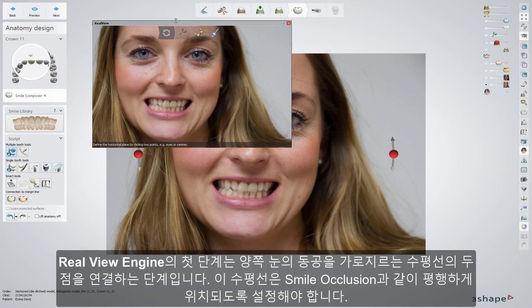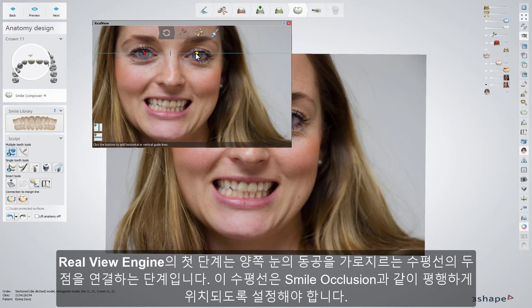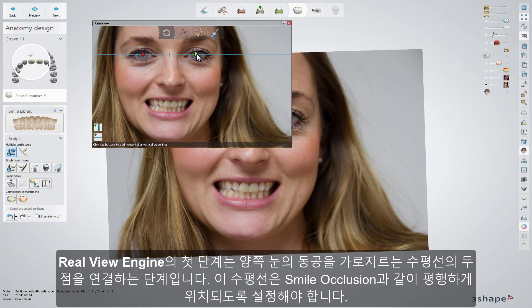The first step of the RealView Engine allows you to set two points of the horizontal line across the pupils of the eyes. That line will keep the smile occlusion parallel with the eyes. If the angulation of the line needs to be adjusted, click on one of the points and move it. Clicking on the line gives you the possibility to shift it with no change in angulation.